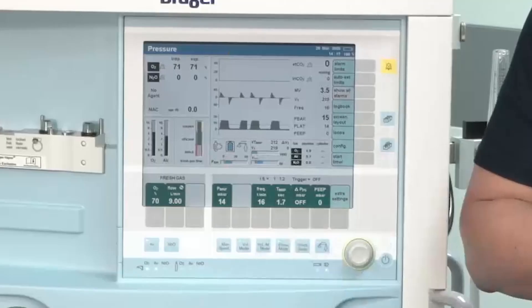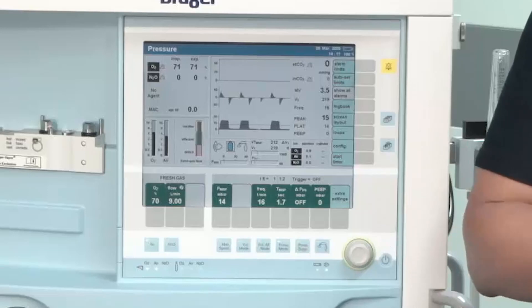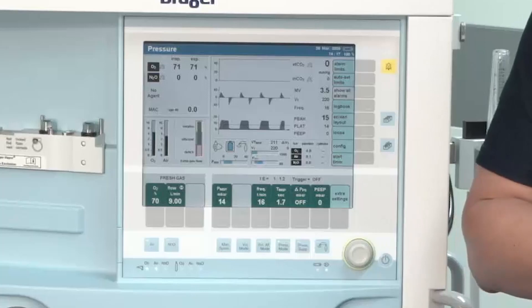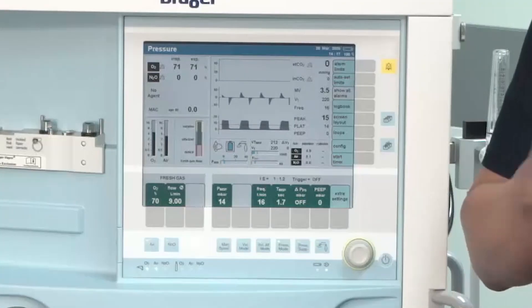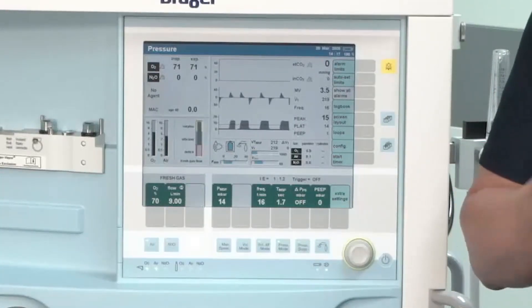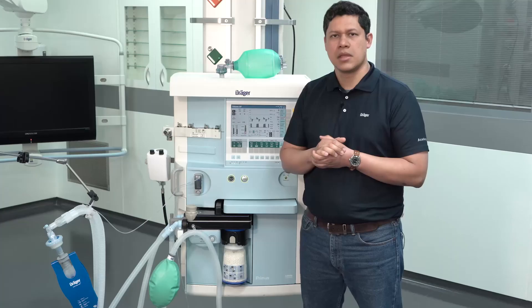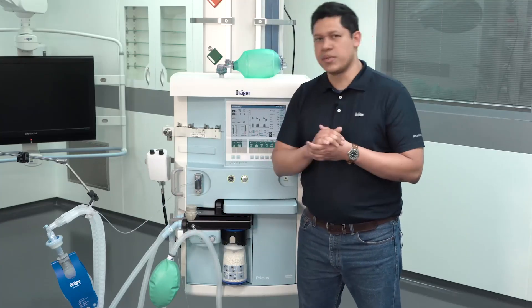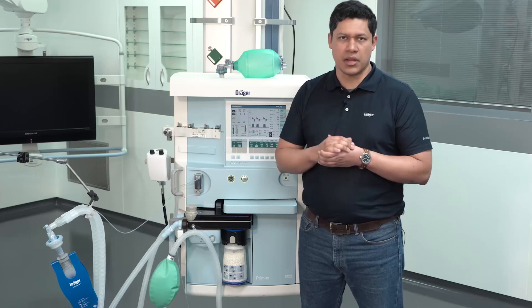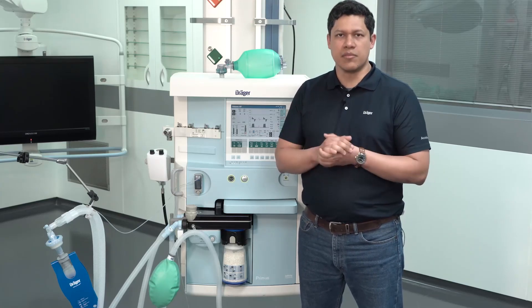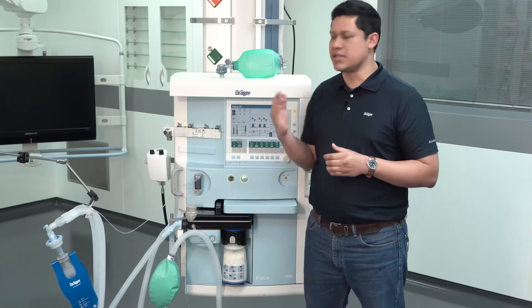You have to constantly visually monitor the values of FiO2 and CO2. Because of the rebreathing system, the measured values might differ slightly from the set ones. Be aware that the manual breathing bag should be full and evenly filled, and that it will be moving in synchronization with the ventilation.